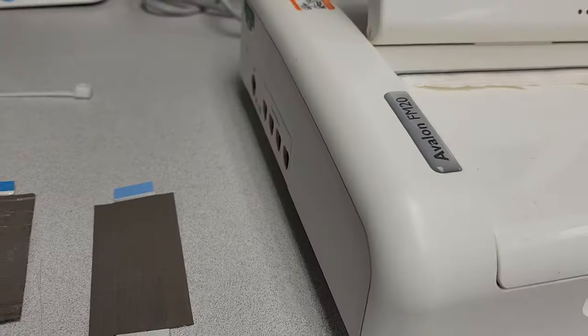Today I want to talk to you guys about cables and how they might look like they're fine, but they'll actually create a lot of problems for you. So let's go ahead, let's flip this around, let's go take a look at an Avalon FM20 fetal monitor. Interesting, never seen one of these before, but you never know, it's going to come across your desk, and here it is. Let's take a look.